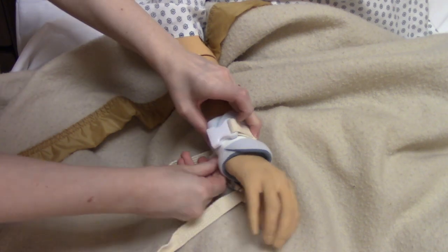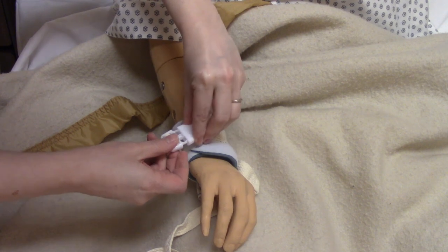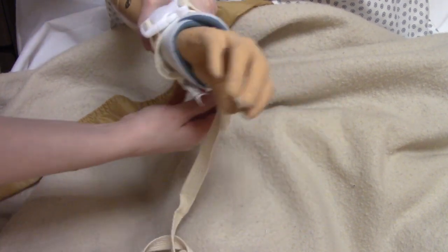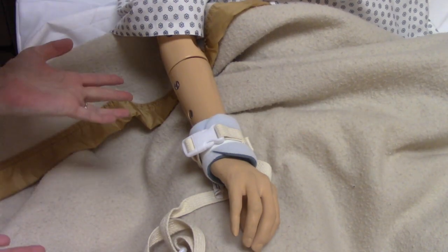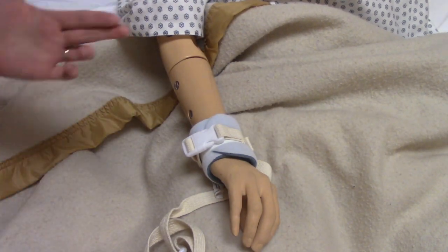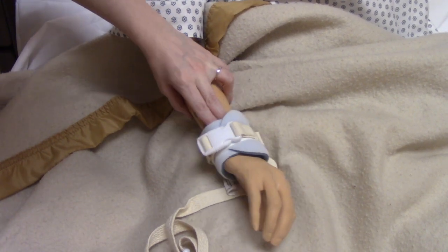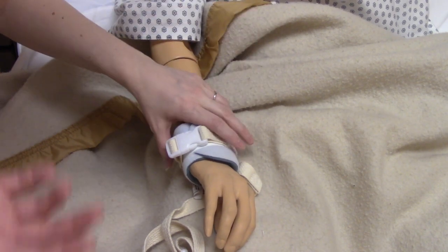So we'll do it like this. Then you're going to use the Velcro and then you're going to use the buckle, and you can tighten and adjust the buckle. How do you know if it's too tight or too loose? You should be able to fit two fingers underneath. If it's too tight, that won't work and it'll cut off the patient's circulation, which would obviously be bad.